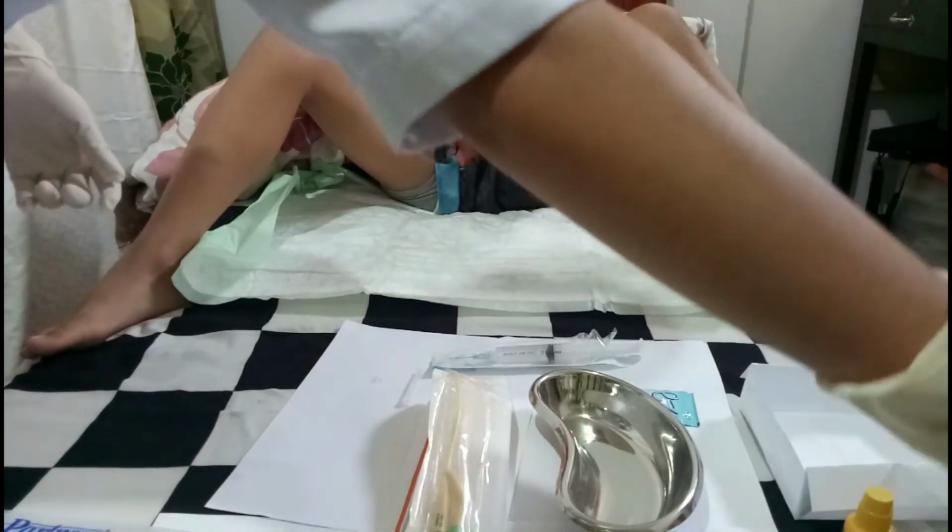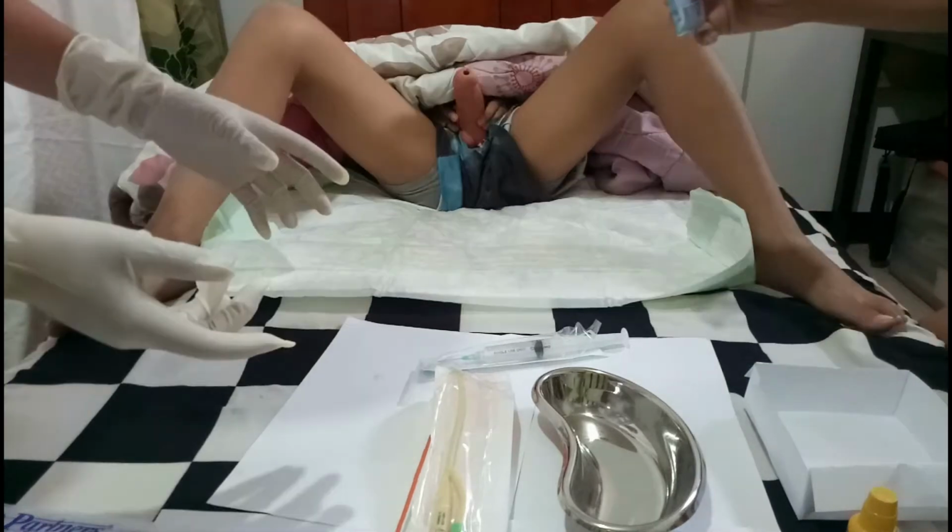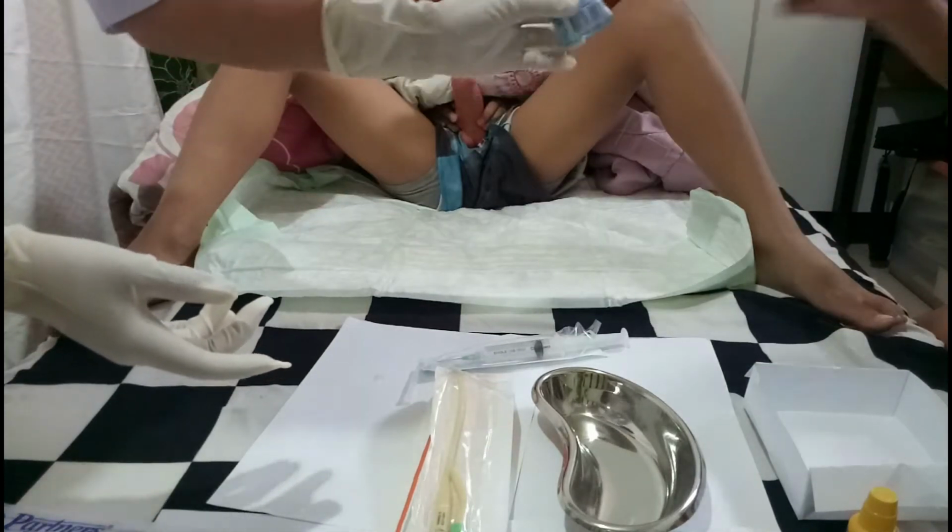Then, this one. So now I'll ask the nurse to open the easy lubricant jelly and put it on the kidney basin. Can you open this one, please? Thank you.